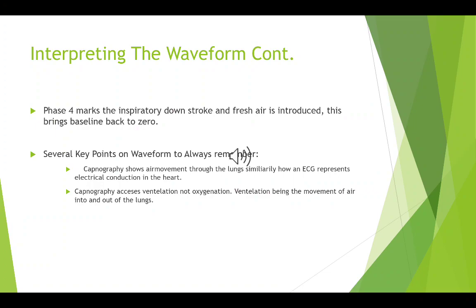There's a few things that are interesting to remember. Capnography shows movement through the lungs, so it's kind of similar to an EKG, which represents electrical conduction through the heart. Capnography only assesses ventilation, not oxygenation.